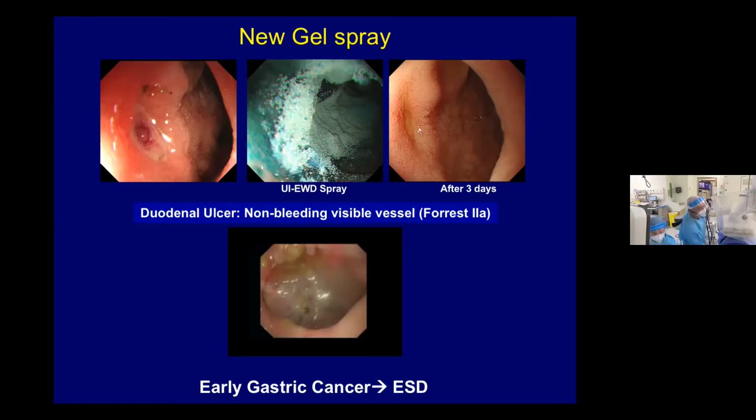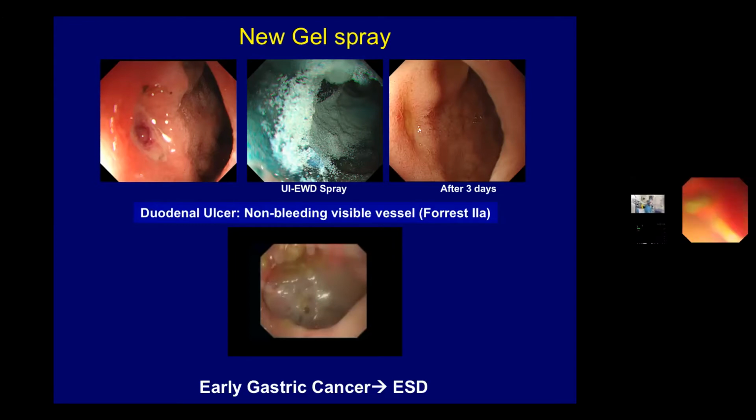So many of these future gels are going to come. I believe that these gels can be used not only to prevent bleeding, but also to dissect tissues. And this is something that's going to happen. You inject the gel submucosally, and it's going to do a spontaneous auto dissection of the tissues. Similarly, to close perforations, probably we'll be using gels like this. So gel engineering is getting into, I think this is a big area.